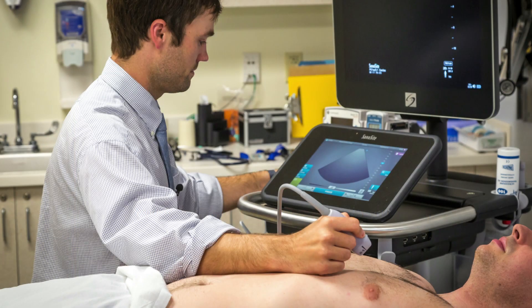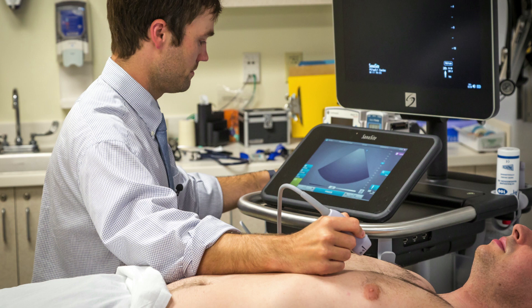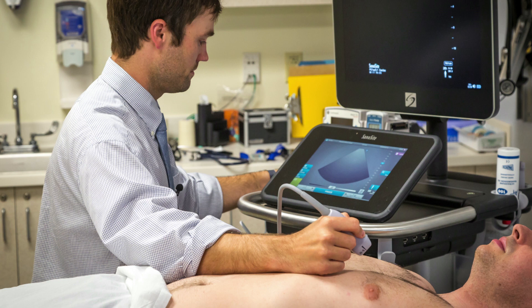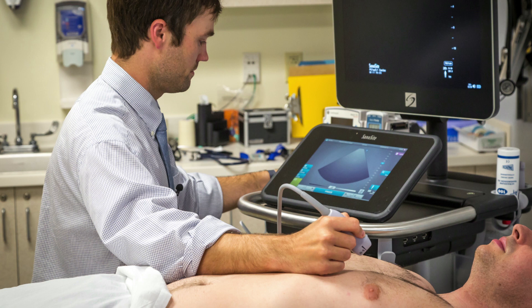The provider should position himself and the ultrasound machine to the patient's right. Typically, the patient will be in the supine position. Correct orientation of the probe and screen are critically important for imaging acquisition. In general, lung ultrasound is always completed with the probe marker pointed towards the patient's head and the screen marker aligned to the left of the ultrasound screen. Focus echocardiography is completed with varying positions of the probe marker depending on the desired view, but the screen marker will remain aligned to the right of the ultrasound screen for all echo views.